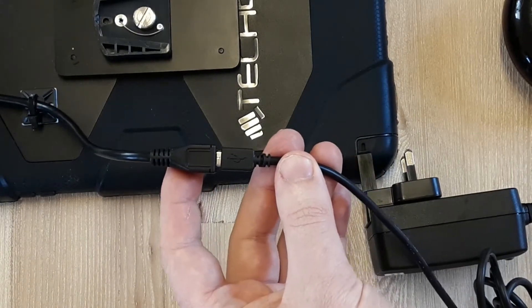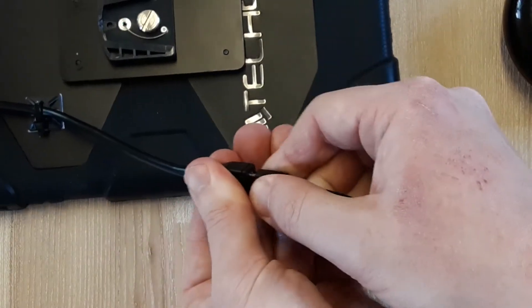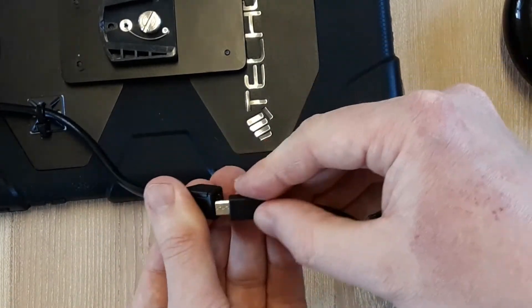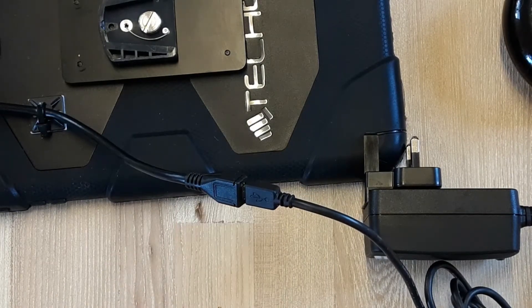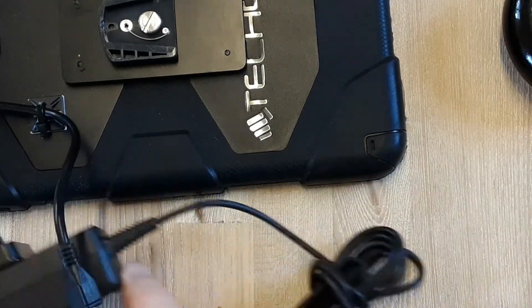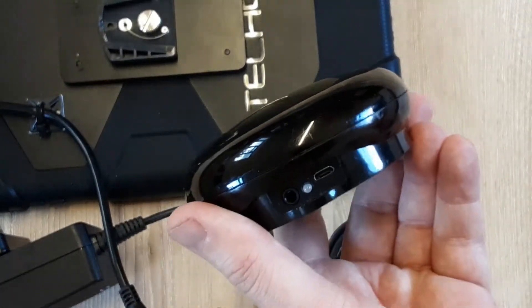Inserting the unit should be very easy and there should be no force applied. The same is the case for the hub.